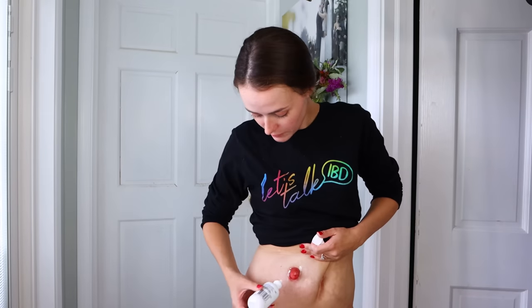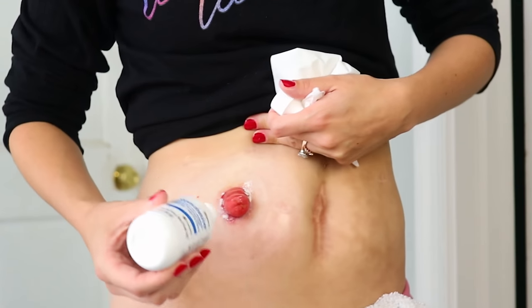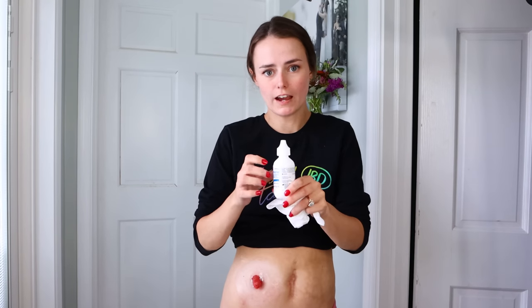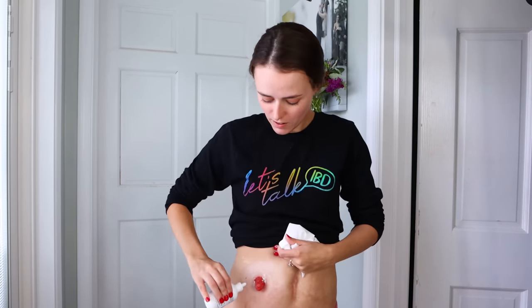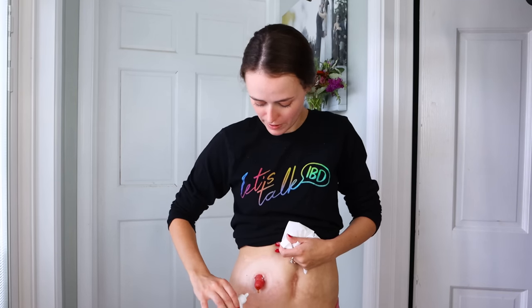I also see some irritation underneath my stoma, and that's important too. For the patient who's looking down at their stoma, it's important to remind them to look underneath as well. It can be helpful for them to do this in the bathroom mirror so they can see what's going on underneath. I'm going to add a little bit of powder underneath here. My tip is to get air to the top of the bottle and use it to brush away extra stoma powder.